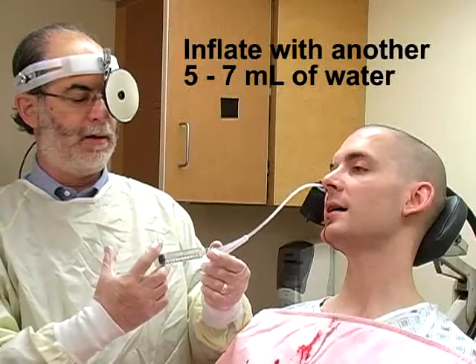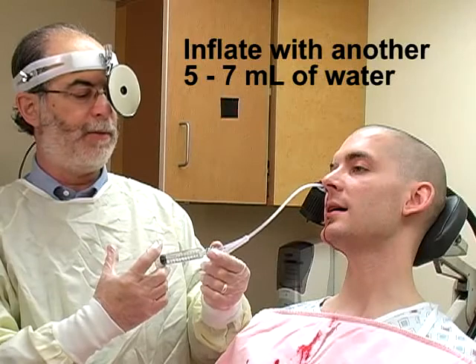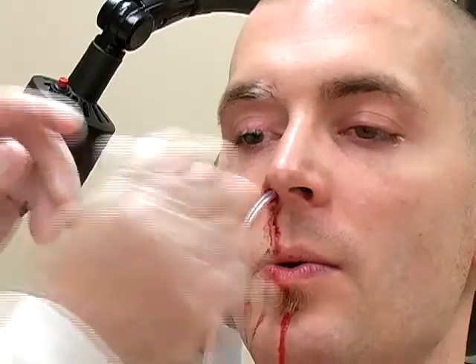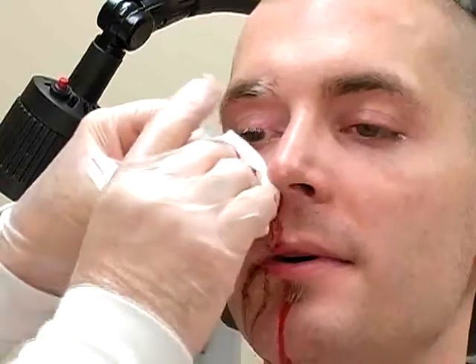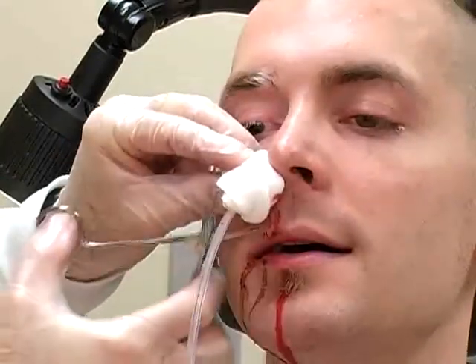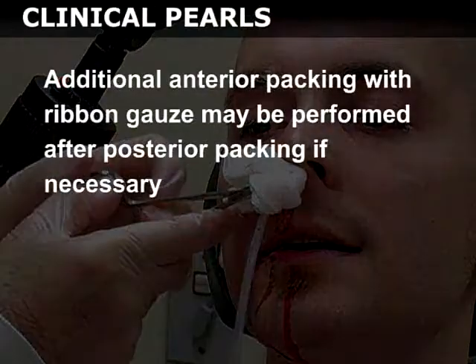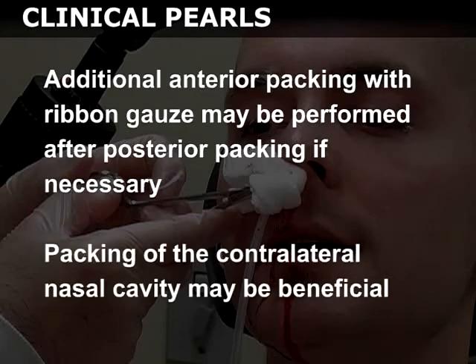Then slowly inflate the balloon with another 5 to 7 milliliters of water. Finally, place a piece of gauze around the catheter at the nares and place a clamp on the catheter to prevent posterior migration. Additional anterior packing with ribbon gauze may be performed after posterior packing if necessary. Packing of the contralateral nasal cavity may be beneficial to provide additional tamponade and to prevent septal deviation.